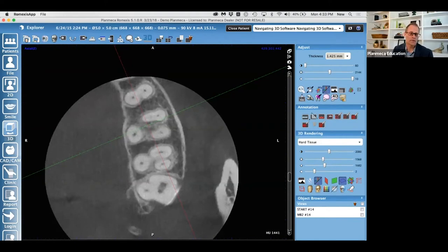Correct. Yep. So if you're going to look for a fracture, for example, you're probably going to want to take the image at the highest resolution the machine can produce. So for example, this is taken at a 0.075, a 75 micron voxel size. That's where I'm looking for a fracture, and that's probably about it. MB2s, regular pathology, abscesses, all can be seen at 200 microns, normal resolution.